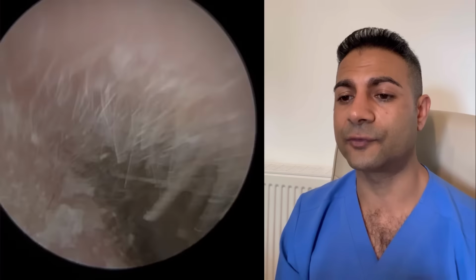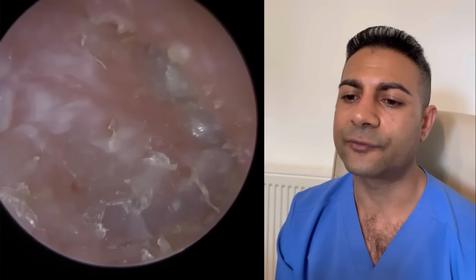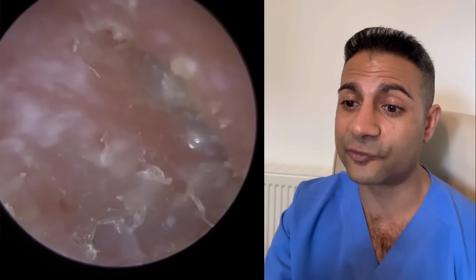So just some residual skin. I could potentially have left this, but I just want to clear as much debris and dead skin as possible. The reason for that is when this patient does get their medication, it's going to allow the medication to really penetrate the surface of the skin that's infected. So I'm really pleased with that. I can at least visualize the eardrum. I can see the hammer bone.